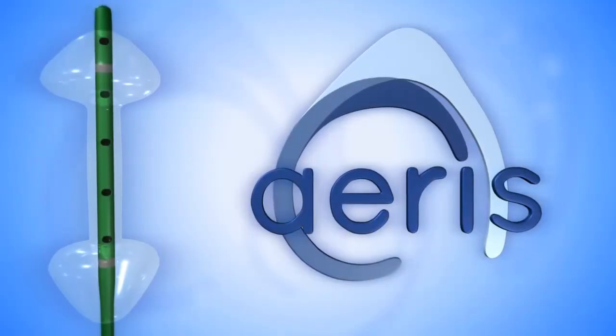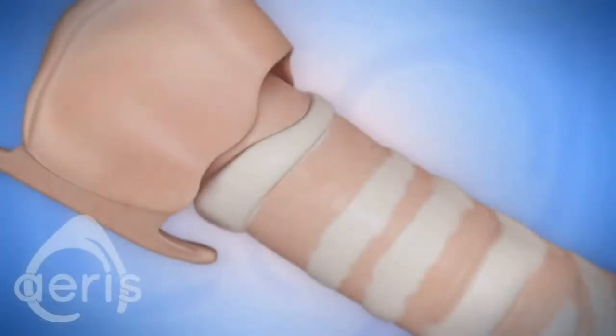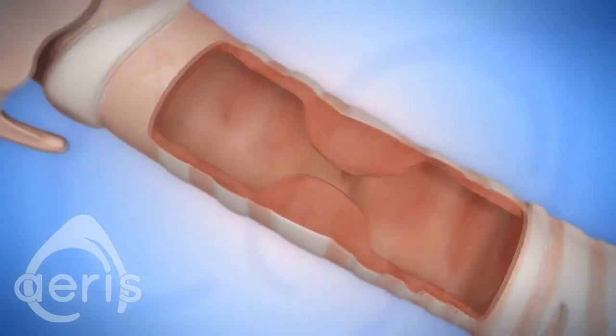The aeris balloon catheter is designed specifically for the unique challenges of dilating airway strictures. An effective airway dilation procedure must be completed safely and expediently.